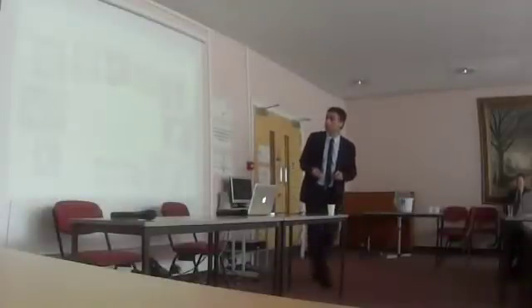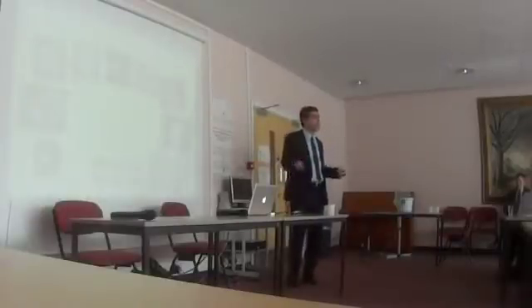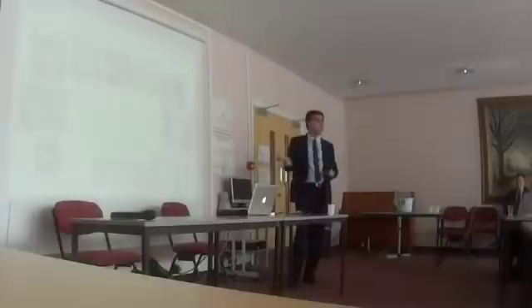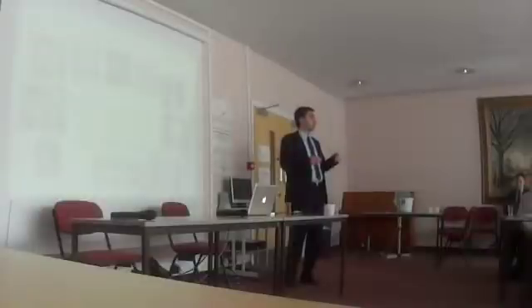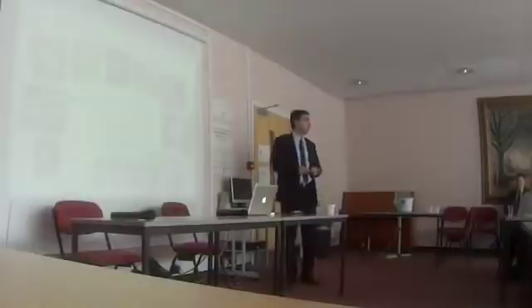It is not as good as you can see on my screen, but overall we can look at all aspects of the heart, including the things that we can do with echocardiogram, for example in this view, you can look at the heart valves. It is less likely we can get these sort of beautiful images of the coronary arteries. We are not as good as, say, CT scan or coronary angiography to look at the coronaries. But if someone asks whether you can look at the origin of the coronary arteries and their direction, by some maneuvers we can do that.